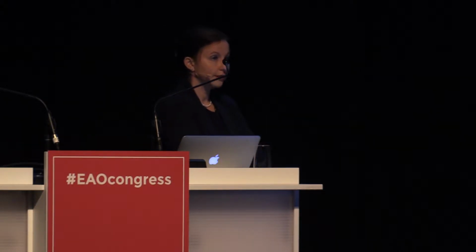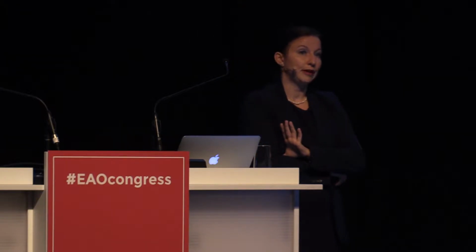And after 1 year, there was no implant failure, or the implant failure was not in these patients. The implant failure after 1 year, as you saw, was in a patient who lost a buccal bone, but he reached the implant stability of 70 and more.